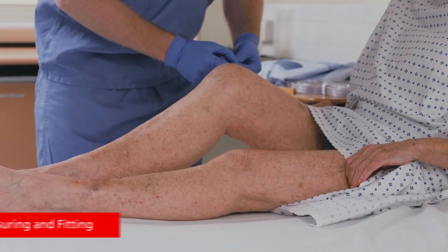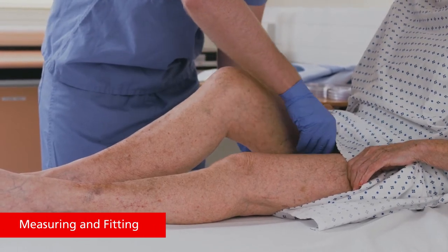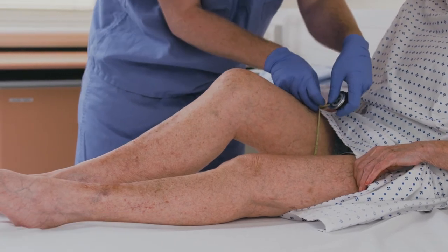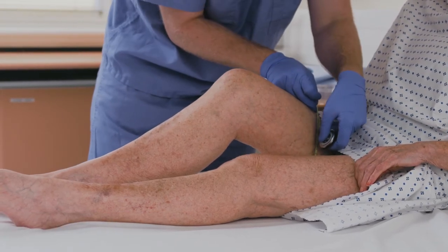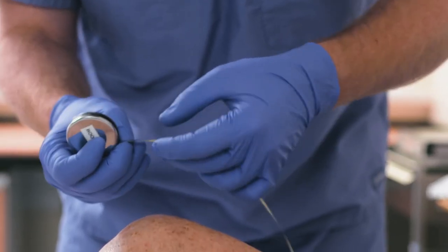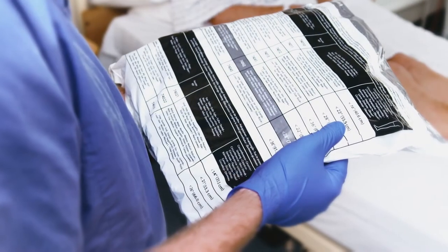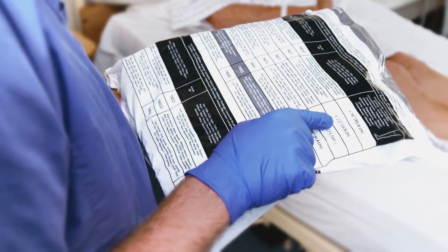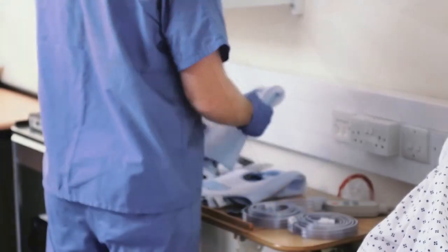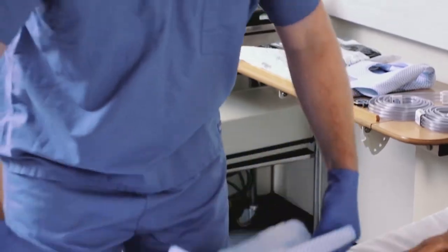Before applying a sleeve, it is important to measure the patient to identify the appropriately sized sleeve. For thigh length sleeves, measure the circumference of the patient's thigh at the widest part, and then refer to the Kendall SCD system sizing chart to determine the correct sleeve size.